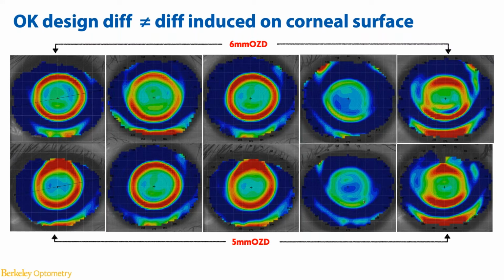And this is making it very important to utilize a randomized controlled study to confirm the anti-myopia efficacy of each design. Because for any retrospective studies, if we randomly selected, let's say, the last two types of topographical change from one design and compared with the first two topographical changes of the other design, we may actually draw the conclusion that the difference we're seeing is a design-specific difference, but in reality, they merely reflected the individual variability in the same design.